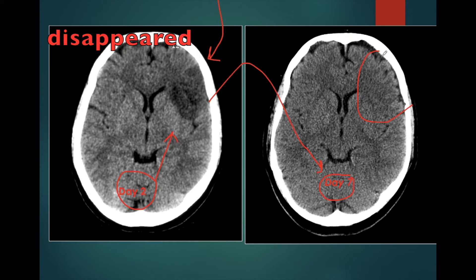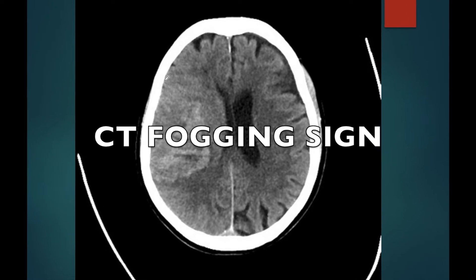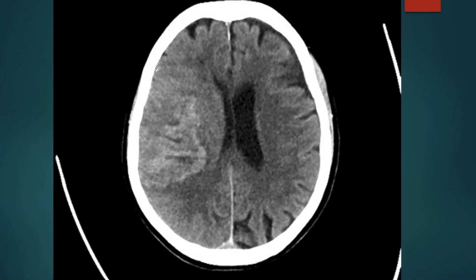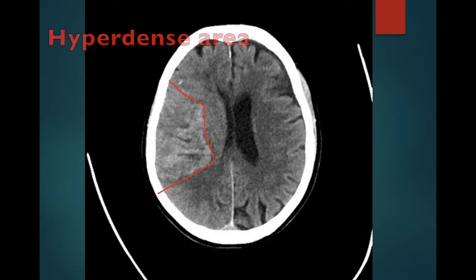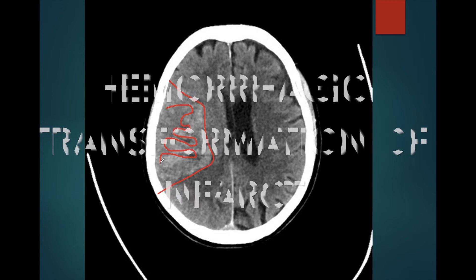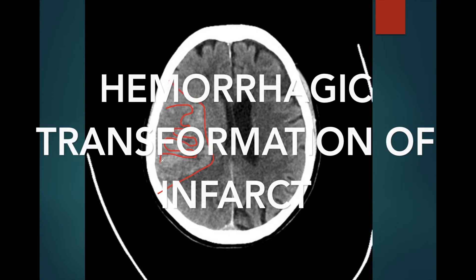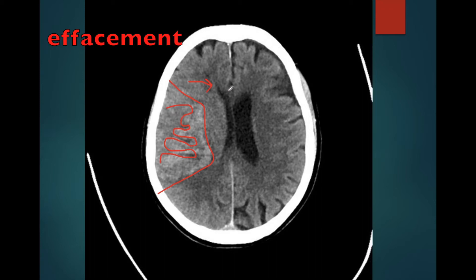In another case at day 8, this patient presented with hyperdense areas in the right frontoparietal region. We can see that the hyperdensity is gyreform in appearance — it resembles the gyri. This gyreform hyperdensity is consistent with hemorrhagic transformation of an infarct and is seen in subacute infarct. We can also see mass effect with effacement of the right lateral ventricle, which appears smaller in size compared to the left lateral ventricle.